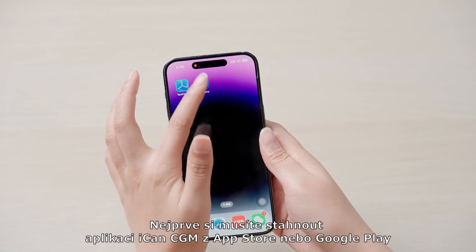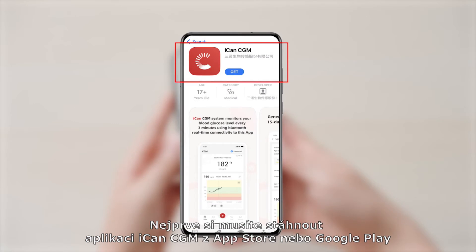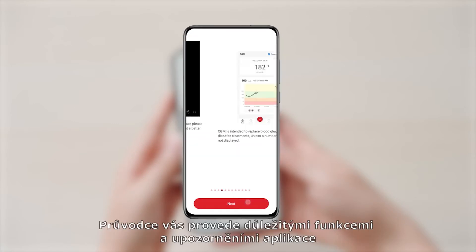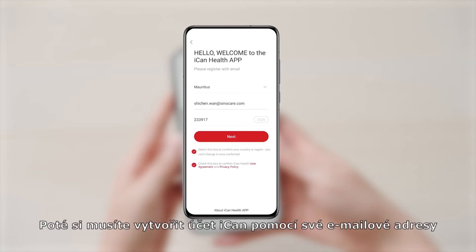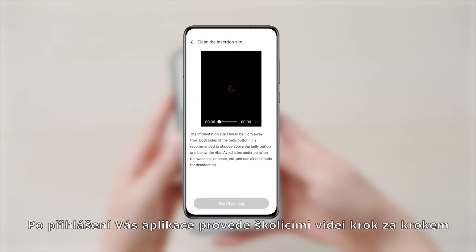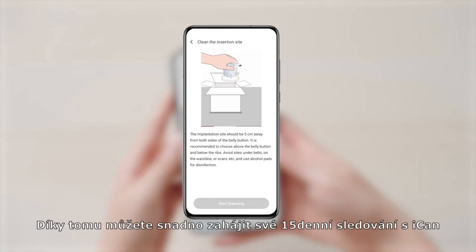The first thing you need to do is download the iCan CGM app from the App Store or Google Play. When you download the app for the first time, there will be a guideline to help you learn cautions and important functions of the app. Then you will need to create an iCan account with your email address. Once logged in, the app walks you through training videos step by step, so you can follow these instructions.